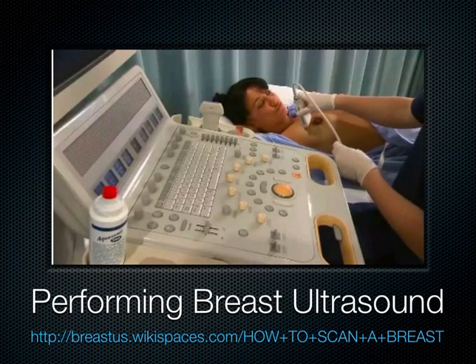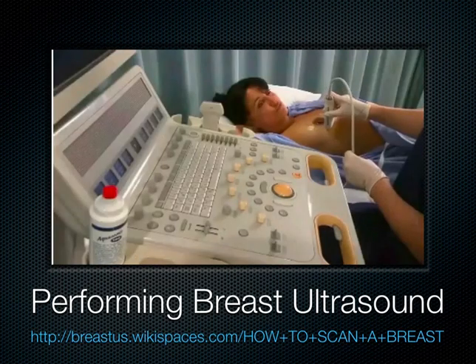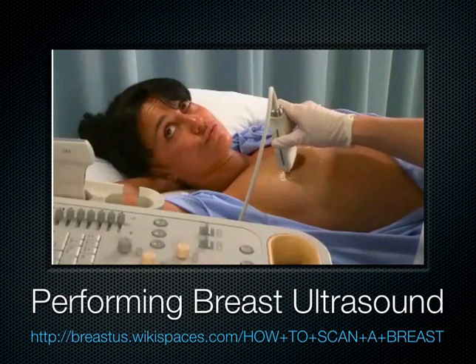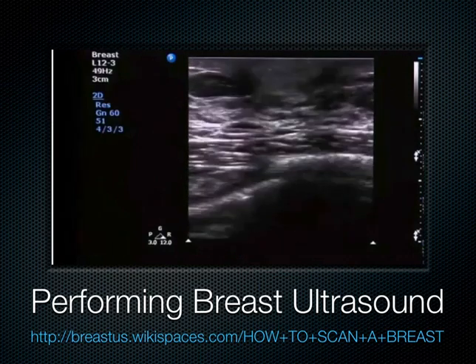Repeat the process for the transverse plane by sliding the transducer from the superior aspect of the areola over the nipple and just beyond the inferior aspect of the areola. Return to the middle of the nipple areola complex and obtain a representative image in the transverse plane.